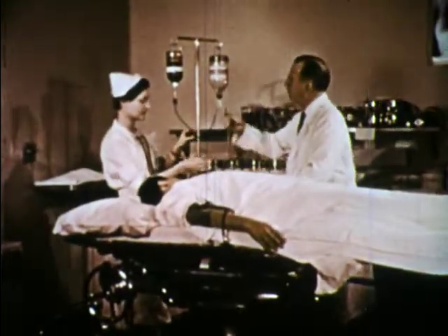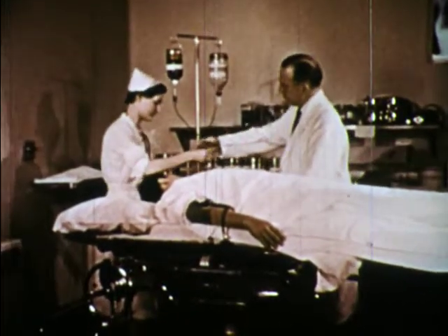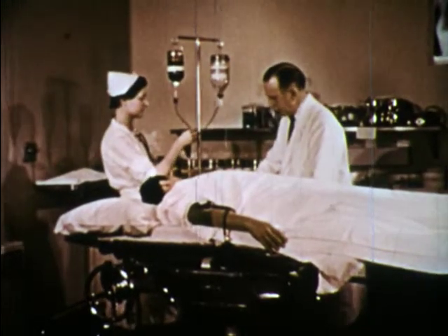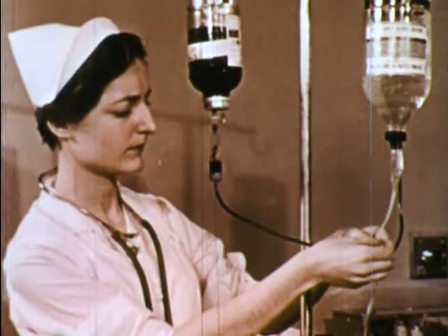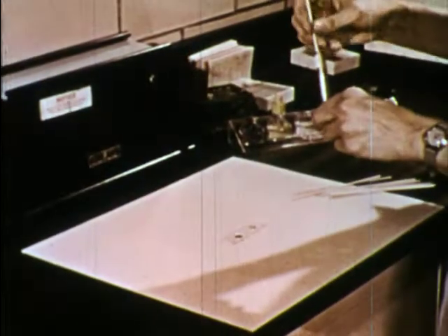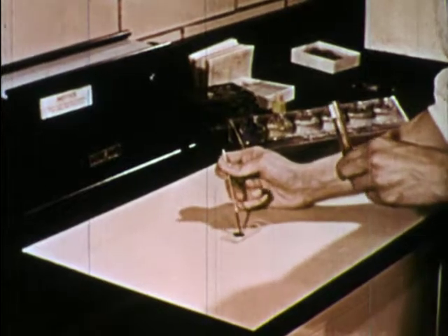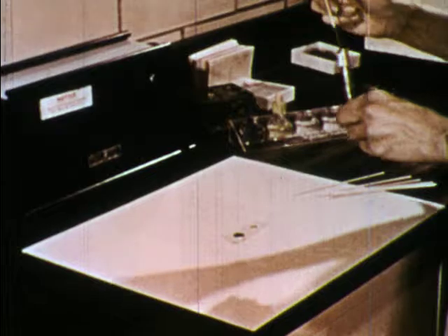Sometimes there is a great loss of blood. Doctors have learned how to replenish the natural supply through blood transfusion. An untold number of lives has been saved through the discovery of this technique. It has been learned that blood from different persons may have different characteristics. We have developed a process of blood typing using two types of serum, usually colored yellow and green for identification.